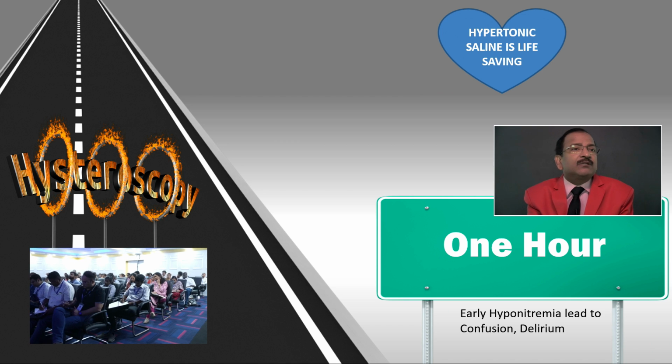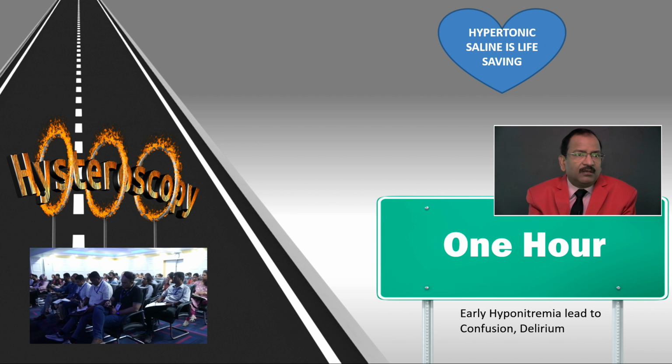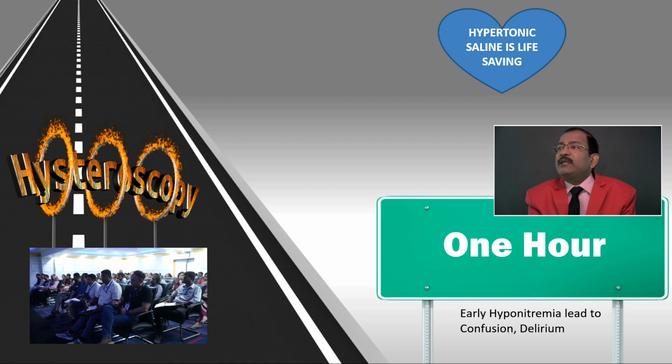You did a hysteroscopy today at 4 p.m. and you took 2 hours, so at 6 p.m. you have finished your procedure. During surgery, hyponatremia will not happen. Do you know why? It takes time. Post-operatively it happens.